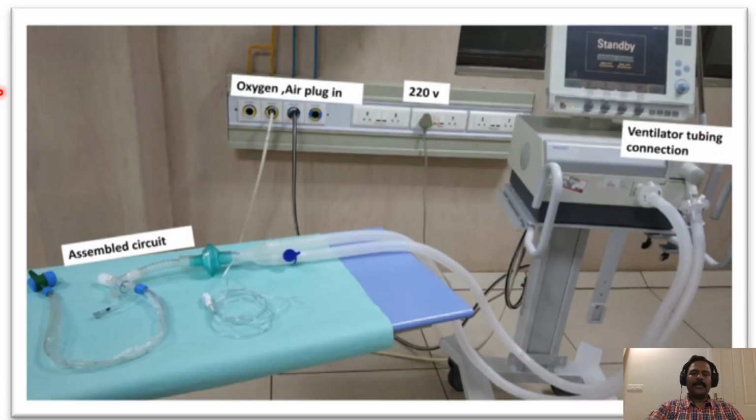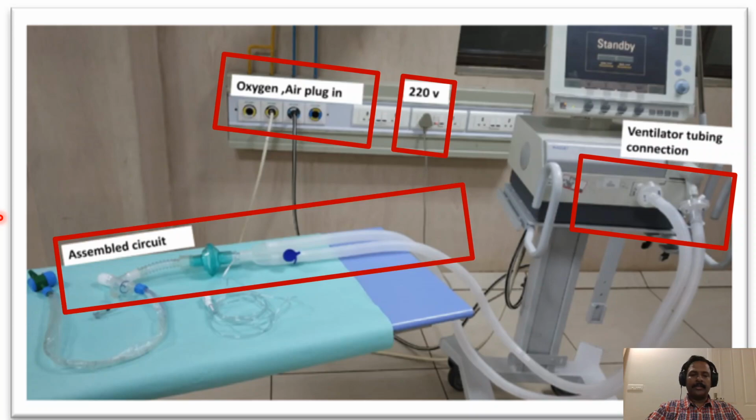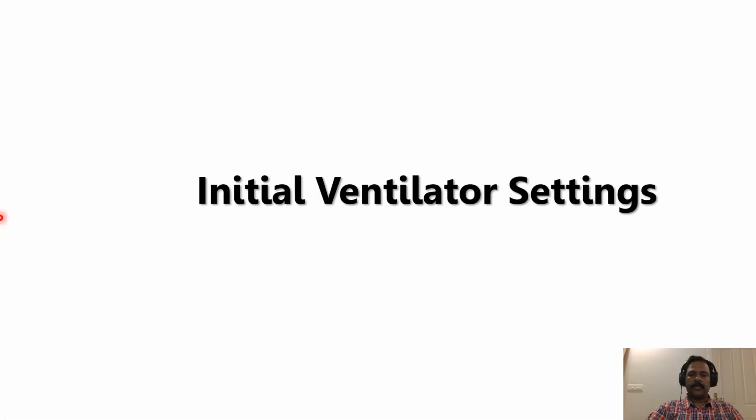So this is how we are setting the ventilator. We have connected the oxygen as well as air. We have a plug point for the ventilator, and this is the assembled circuit which is connected to the ventilator. So once again, we will connect the oxygen, air, switch on the plug, and connect one end of the ventilator tubing to the ventilator, and the other end we will keep assembled and connect to the patient once he is intubated.